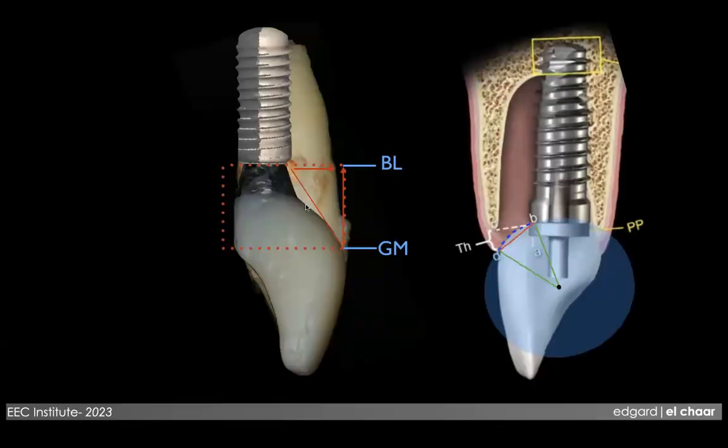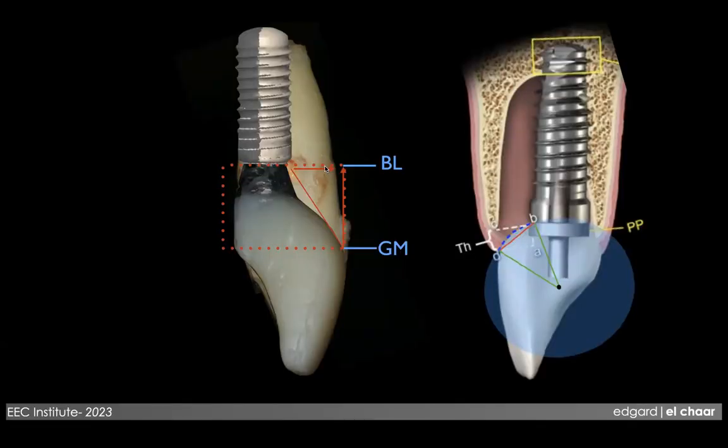You don't want to have bone more than that, because that is really an idiocy that was made by some colleagues. Unfortunately, I hate to say that about colleagues, especially people that I know very well, because you are creating extra bone outside, that's a foreign body that can get infected. And that's why you need to work only with specialists of surgery, not people who do crowns and bridges that are learning how to do an implant and publish papers. So that's very important to rely on people who understand biology and have experience in that.